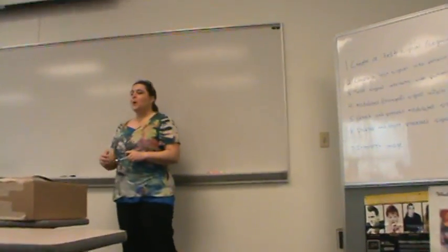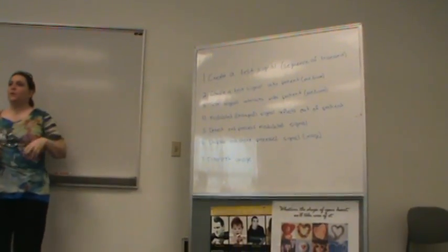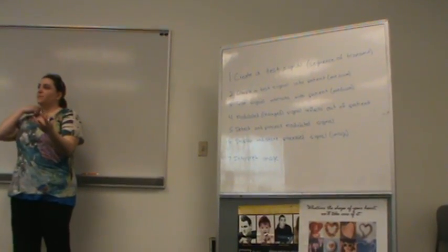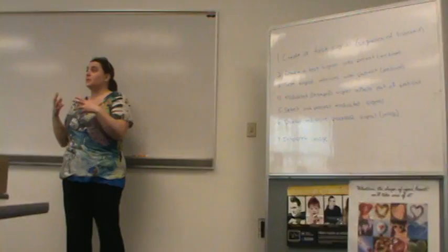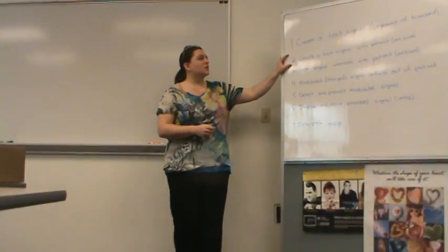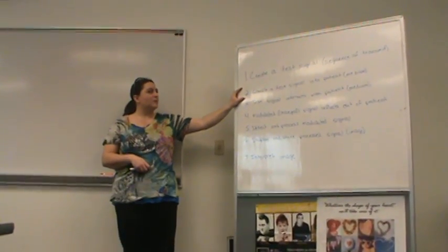Machines are doing, and what we're doing when we're doing an exam. So when we're doing an exam, we're going to create a test signal. We turn a bunch of knobs and we create an ultrasound wave that we're going to send into the patient. And depending on what the knobs are that we turn, that changes what the signal is that's leaving the ultrasound system. And then we have to get it into the patient, so that's the purpose of the transducer. We have to get the signal into the patient.